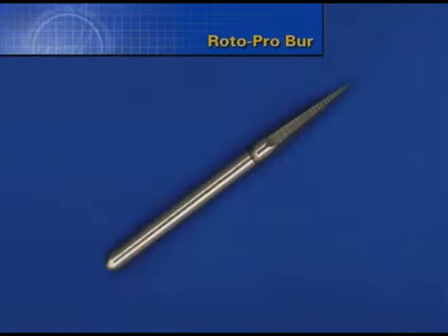Ultrasonics is an excellent initial choice to impart energy to loosen and remove some posts. The 6-sided, regular tip RotoPro burr simply inserts into any friction grip handpiece. When the instrument is rotated at 200,000 RPMs, its 6 edges produce 1.2 million vibrations per minute.